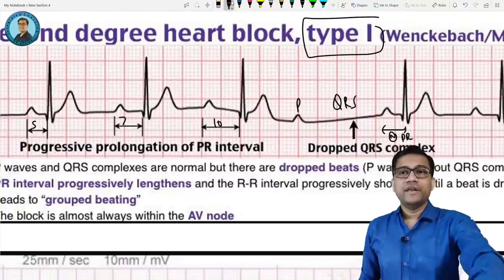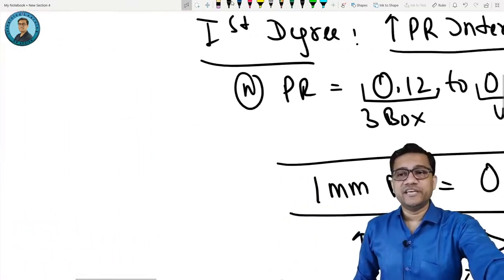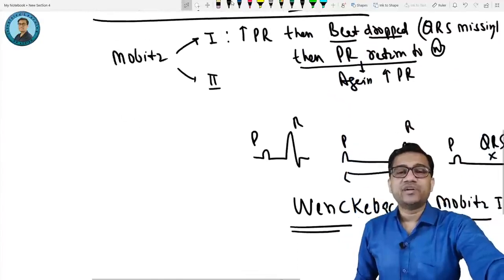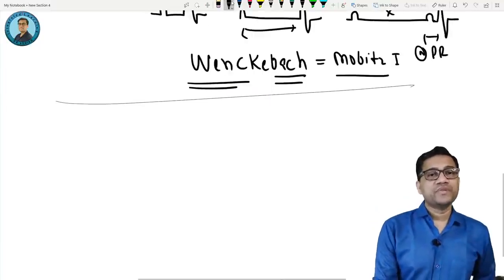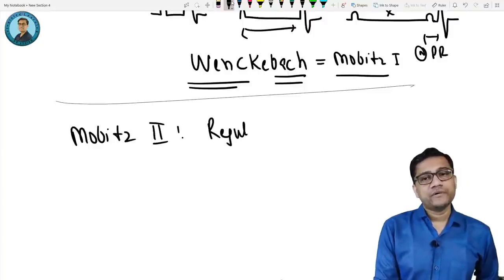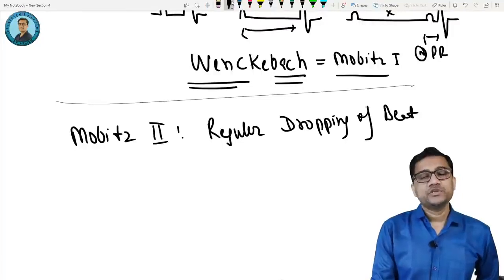Now if the husband doesn't change, will he improve? No, he will not improve, and that causes regular dropping of the beats. So what happens? Regular dropping of beats. Right? Mobitz 2. What happens? Regular dropping of beats.